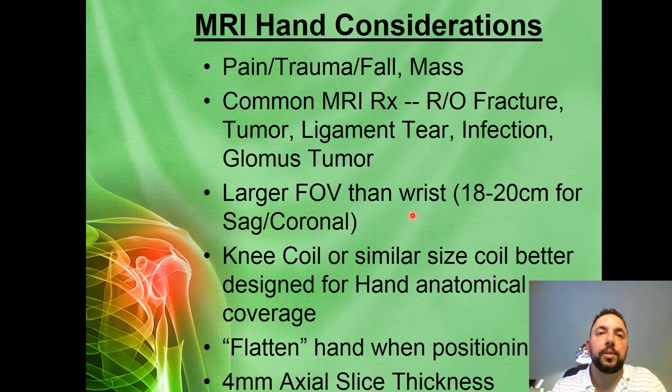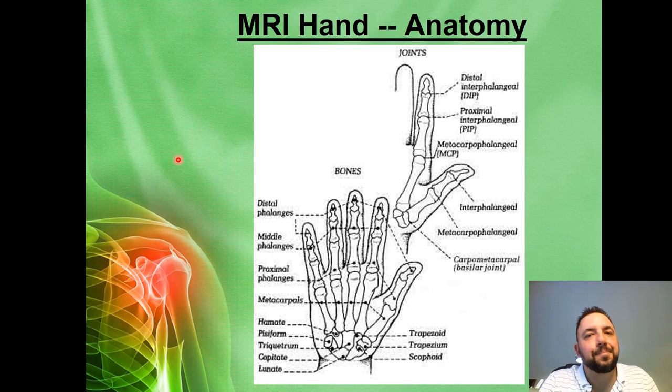the coil. I'll put the patient's hand down on the sheet, put another sheet on the back of the patient's hand, put the flex coil down, and put a strap across the top of it. Then put a sandbag on both sides. It helps to immobilize the patient's hand and gives me optimal signal. But the most important is that their fingers and hand are in an even plane, so that when I'm obtaining my coronal slices, I have a parallel plane with which to work. So flattening the hand is crucial to really the best signal quality that you can possibly get.